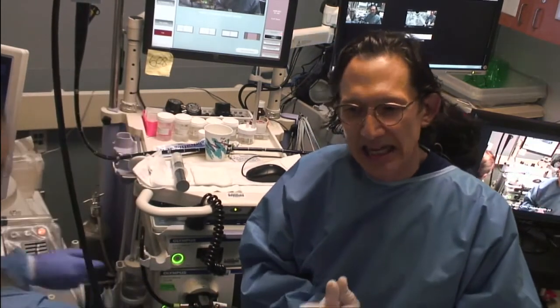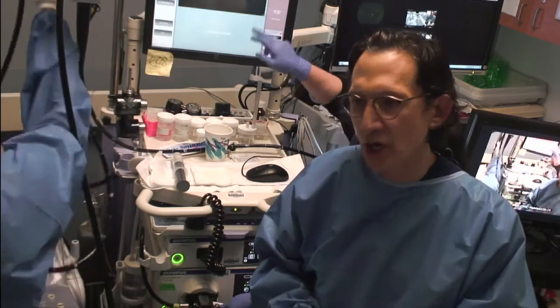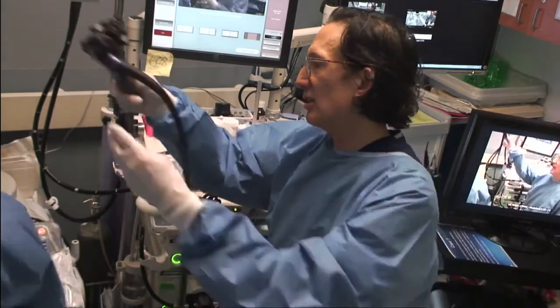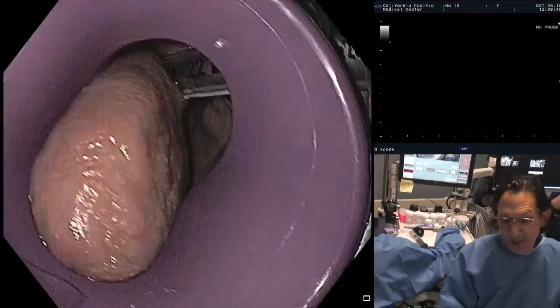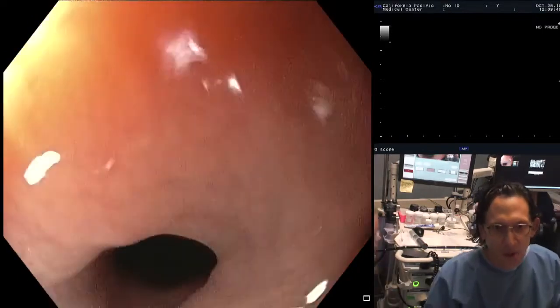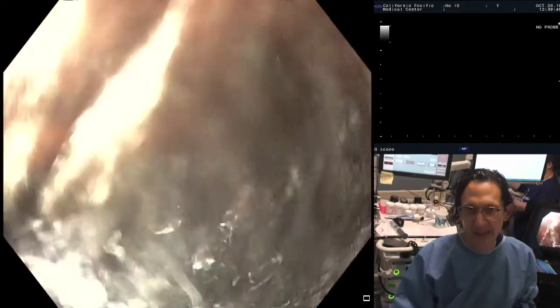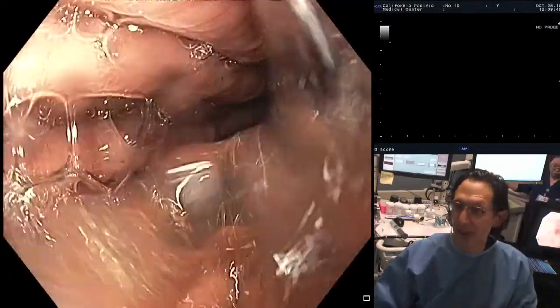So the teaching point is identify patients with large gastrorenal collaterals, because those are much higher risk, and maybe even consider a multidisciplinary discussion whether BRTO might be a better option, because the Japanese literature has reported very nice results for these large gastrorenal shunts using BRTO. So that's the one teaching point here. If you do embark on this, limit your treatment to just the intramural varices. Don't go outside because you're inviting disaster potentially, with embolization and so forth. And you've got to use your largest coils, and you need to put a lot of glue in.